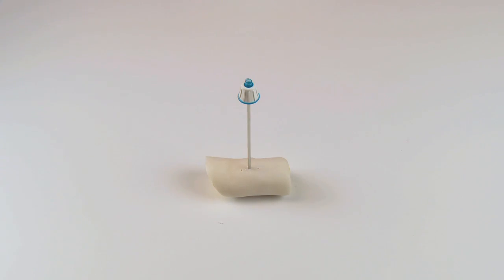The anchored cannula now provides a passage for the desired intervention such as an ablation, injection, or biopsy.